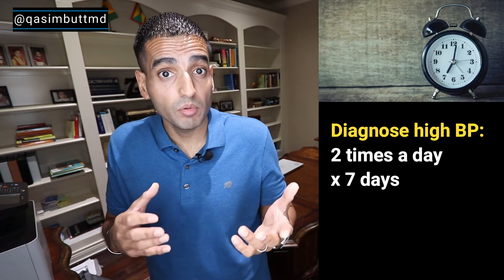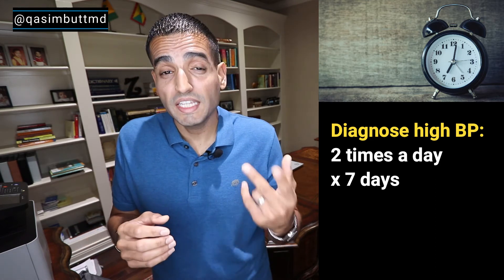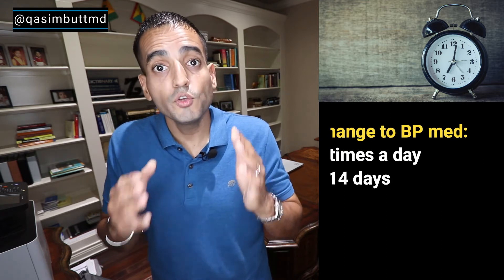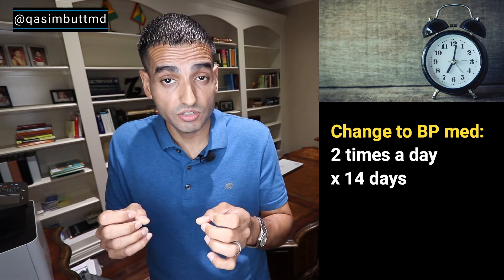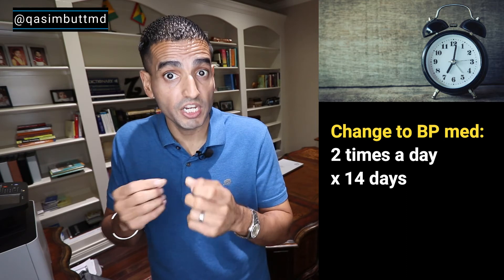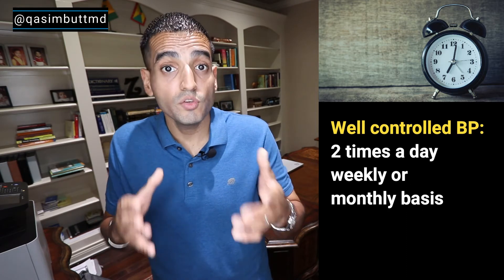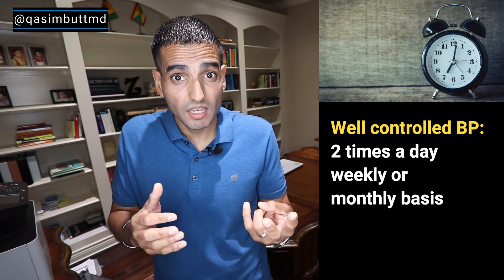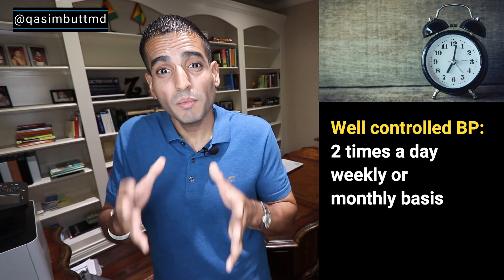How often to take your blood pressure. If you're trying to diagnose yourself with high blood pressure — meaning you've never had it before — I would advise taking it twice a day for seven days straight to get a good idea. If you've had a recent change to your blood pressure medications, I would advise taking it twice a day for 14 days straight to see if that medication change is actually working. If you have well-controlled high blood pressure on medications and it's been stable, then take it twice a day on a weekly or monthly basis just to make sure it's staying stable and normal. Make sure to bring those readings and that log to your doctor's office — that'll get you the best management of your blood pressure.